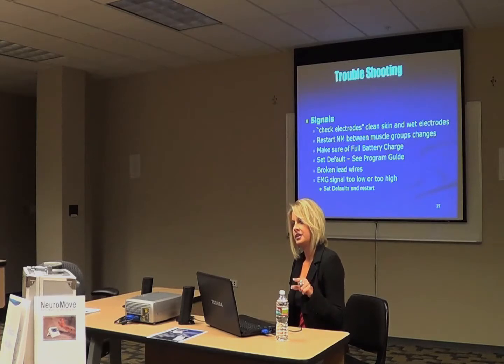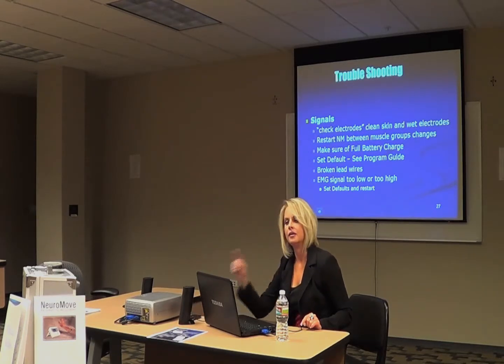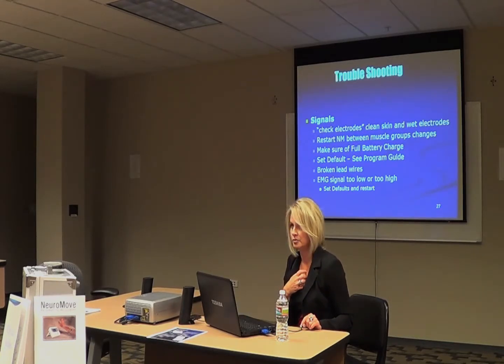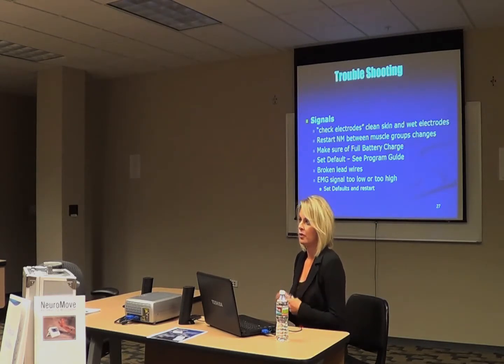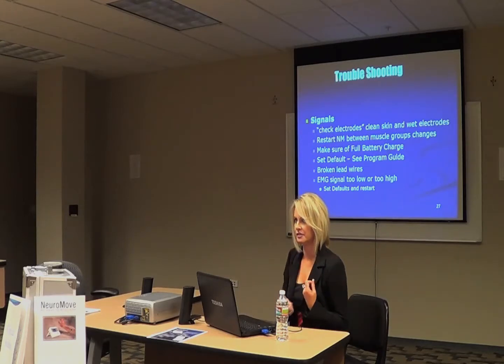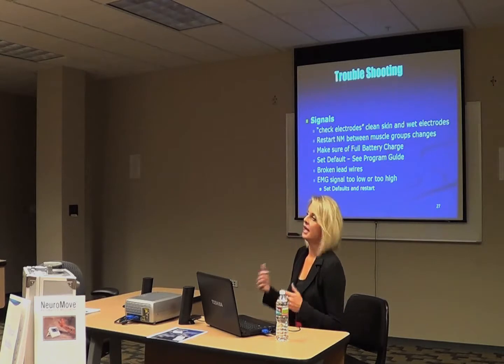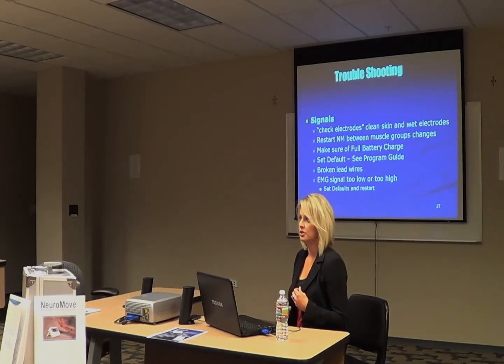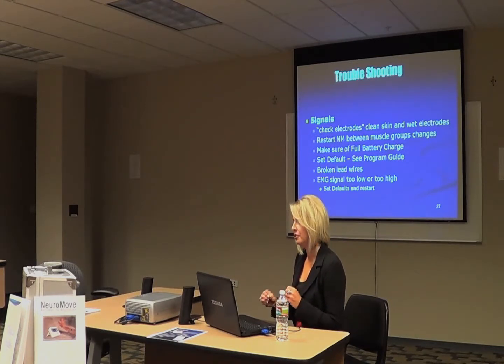Troubleshooting, there is an actual troubleshooting section in that, and I always tell the therapist to please call us if you're having any troubles with it. We don't want you to stumble around trying to fix this and this, and waste a lot of time when you've got a patient, if you're having a difficult time getting it to run. Just give us a call, and we'll run you through the troubleshooting ourselves. And if it needs to have an engineer look at it, we'll do that quickly. If there is really something wrong, we'll overnight you another one. We'll send you a tag to send that one back. So there shouldn't be any real loss of patient time.